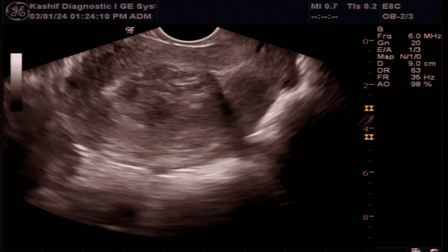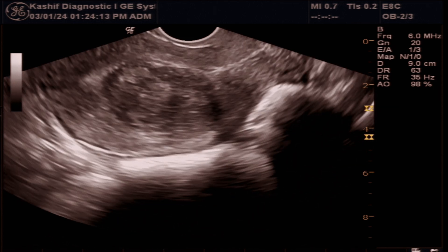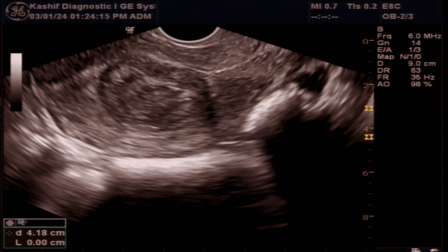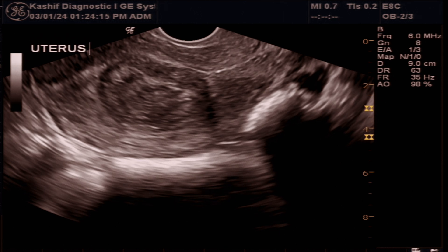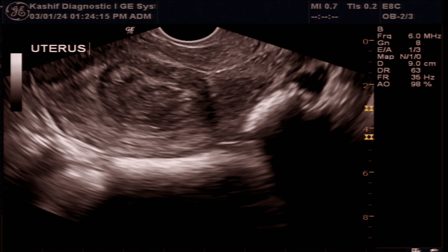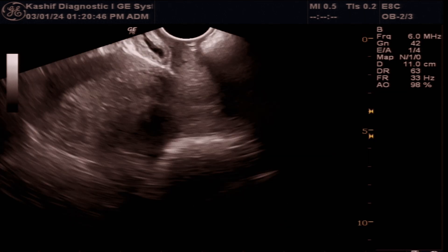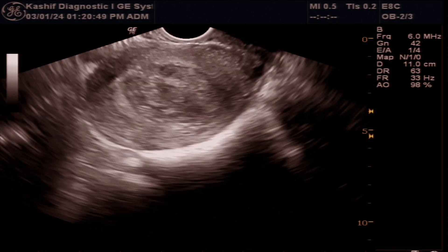In this case we see that the patient is developing good follicles, and this submucosal fibroid is the main cause of the infertility the patient is suffering. Therefore, the submucosal fibroid must be removed. Instead of major surgery, hysteroscopic resection is a simple, safe, and effective treatment if possible.